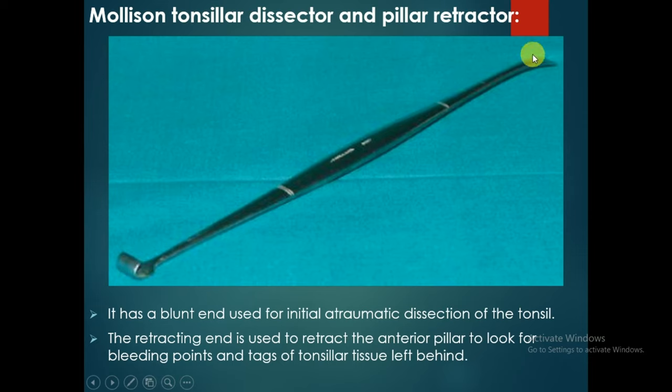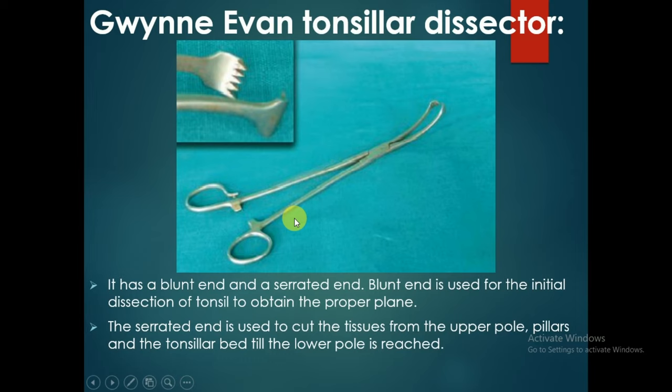The blunt end is used for initial atraumatic dissection of the tonsil. The retracting end is used to retract the anterior pillar to look for bleeding points and tags of tonsillar tissue left behind.